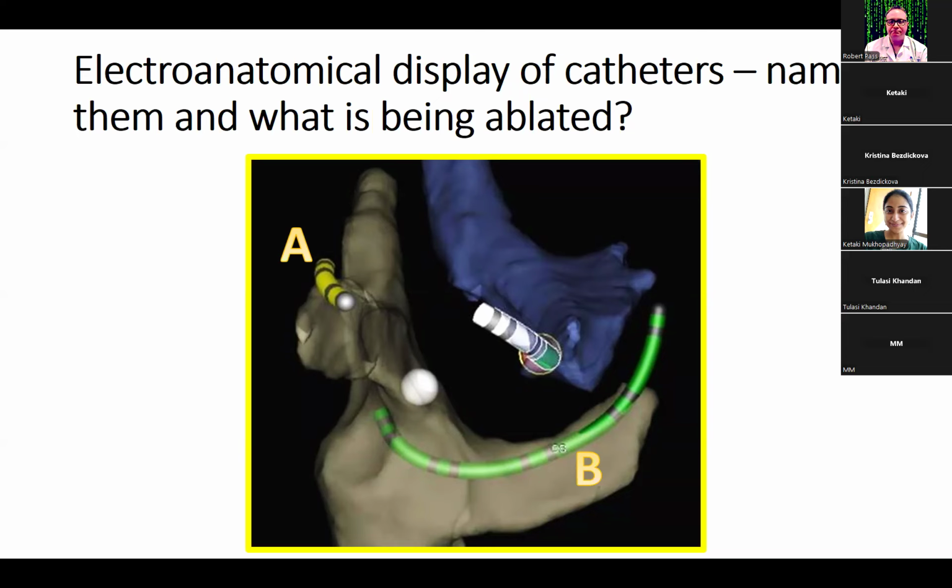I mean, it looks like just how you were mentioning, the catheter doesn't necessarily, you'd have to turn it to go that way versus how it would naturally cross the septum. That's right, yeah. That's one certainly true.